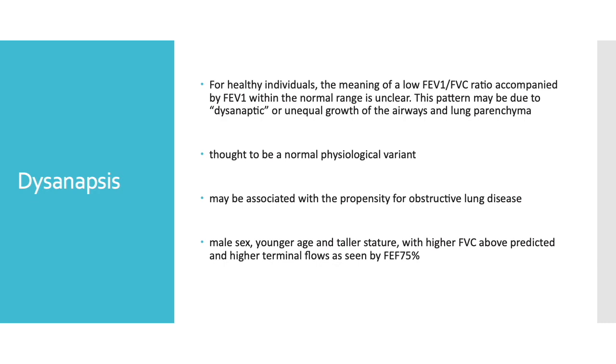Or in these cases there may be an obstructive pattern, depending on whether this patient previously had an obstructive disease. If we do further testing, say we perform a bronchodilator response, or a diffusion lung capacity or gas exchange evaluation, or a muscle strength measurement, we may be able to find out whether this is a normal patient or there is a propensity for an obstructive lung disease.